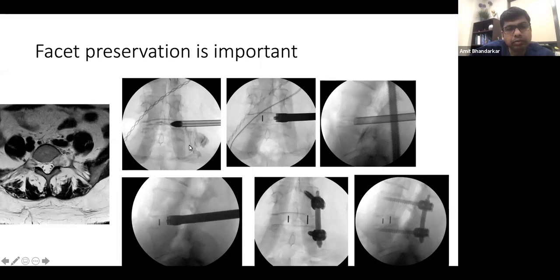Again, this patient, I wanted to do an endoscopic approach. This is because the patient had a huge tarlov cyst there, and it had almost eaten up the pedicle. There was no pedicle on the other side. So I used a facet sparing approach onto the other side. I wanted to preserve that for extra stability. Because there was no pedicle, I was not able to put any pedicle screw there. So I preserved the facet joint and deployed a PEEK cage. Again, the patient was osteopenic. I was not confident that if I expanded a lordotic cage it would hold. I thought it was going to have subsidence, so I used this, and the patient did pretty good.